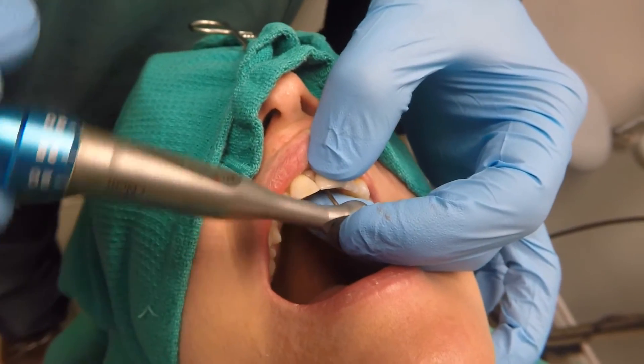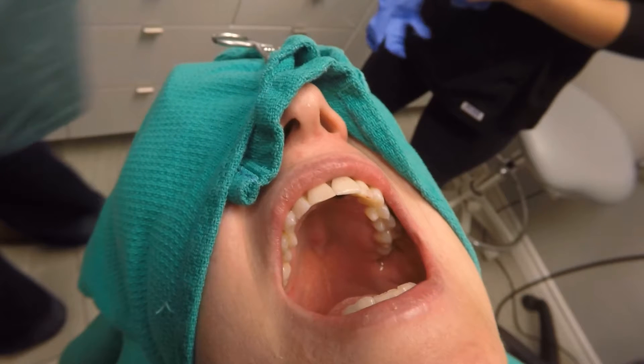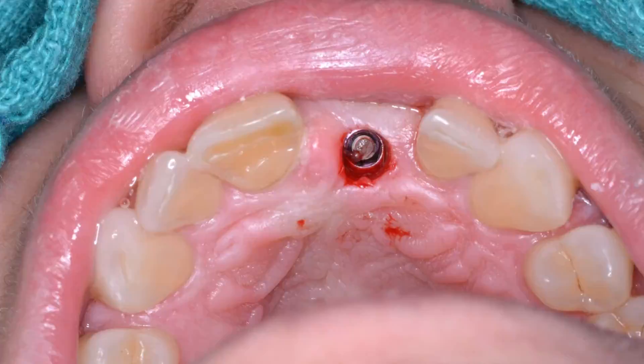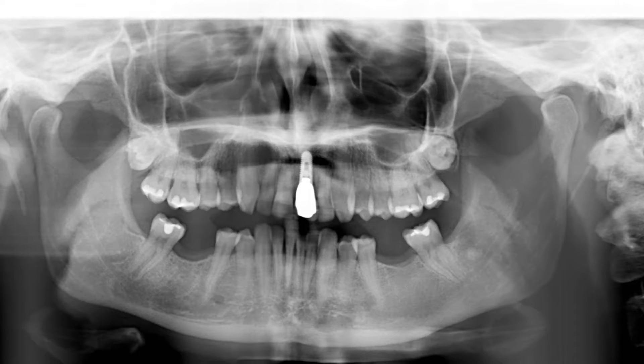The crown is in and it looks really nice. We'll grab the torque wrench now and demonstrate torquing of the implant. Once that's been done and everything's been torqued appropriately, we'll move on to our photographs. In this photograph, you can see a picture of the actual broken segment once the soft tissue cuff was removed. In this next picture, you can see the broken segment of screw that was sitting outside of the implant. This is the tooth back in place with the screw-retained crown. In the panoramic radiograph, you can see that the implant is back in, seated nicely, with no evidence of any bone loss around this tooth, confirmed also in the periapical radiograph.